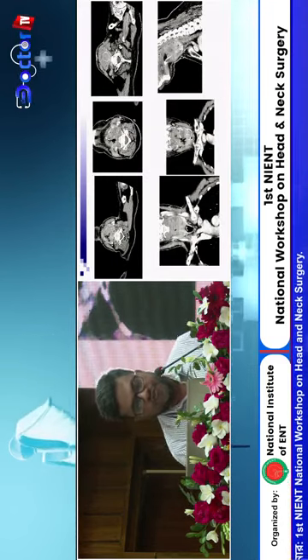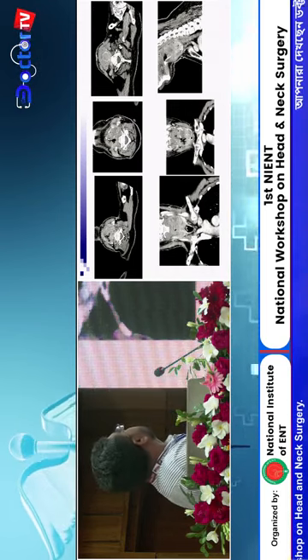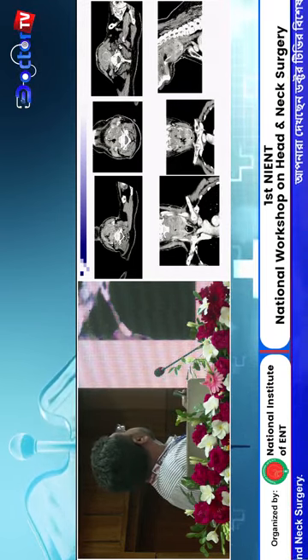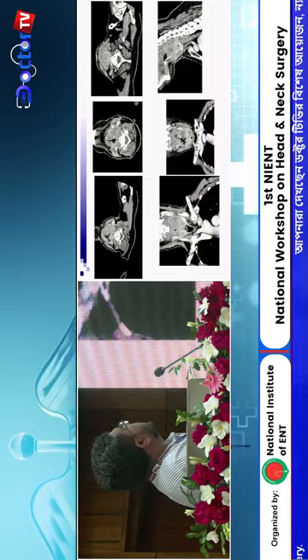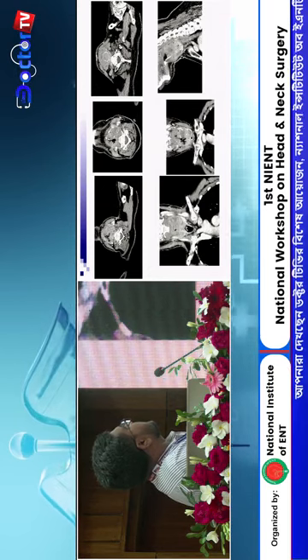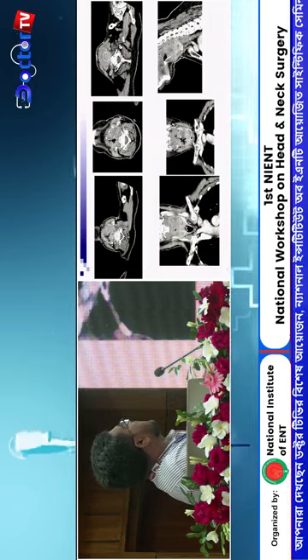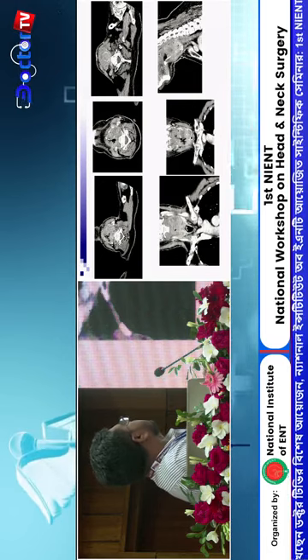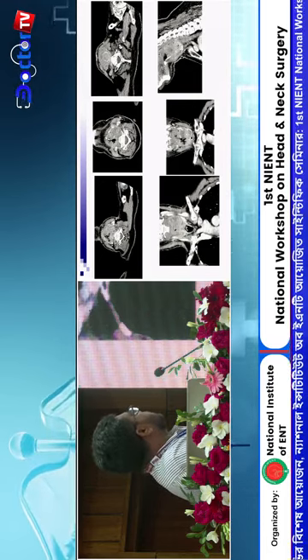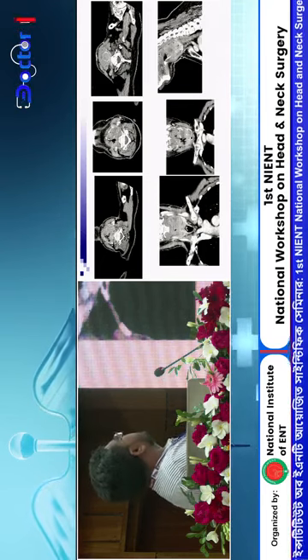And T4B tumor, when we see this, I call it a T4B tumor. Here is the tumor location in the supraglottic area and subglottic area. There is the tracheal ring, and in the subglottic area there is extension to the prevertebral soft tissue, a large soft tissue mass in the prevertebral region. And here we see the lesion involves the left lobe of the thyroid gland. It is a T4B tumor.